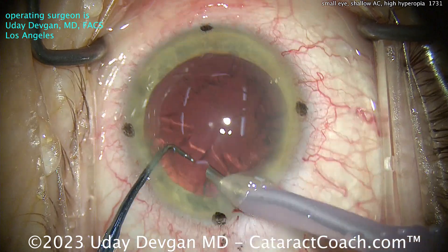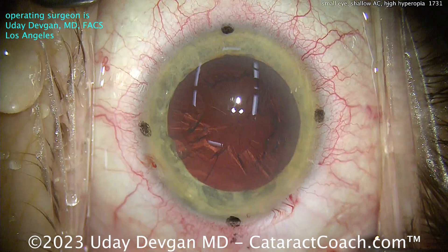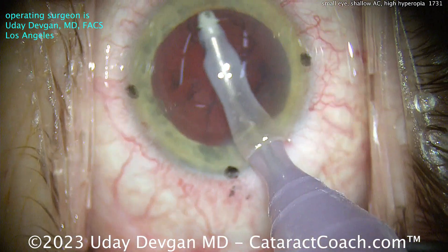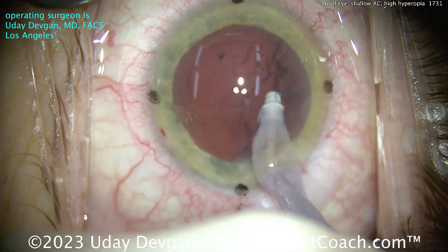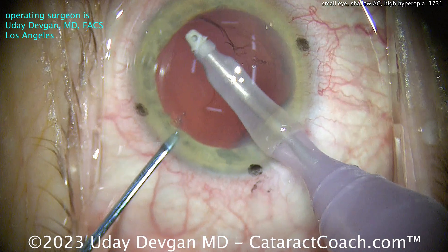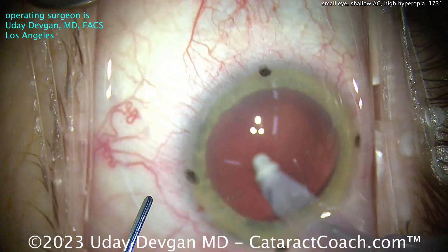Now we'll clean it up. In this patient we're going to put in a 29-diopter IOL — that's a pretty strong power, but it will give the patient the visual range we desire. We decided to put in monofocal lenses: a Tecnis monofocal — the Monofocal ZCB00 — in the dominant eye, aiming for plano or sharpest distance vision. This is the near eye, where we're aiming for a slightly myopic target of about minus one, using the Eyhance lens, which gives just a pinch more range than a standard monofocal lens. Eyhance is a really good lens — it's not an extended depth of focus lens, but it has a little bump in the range that's very helpful in the eye aimed for a myopic target.